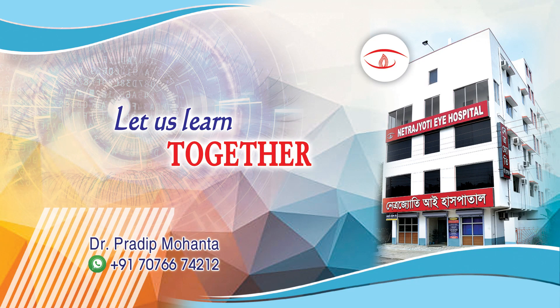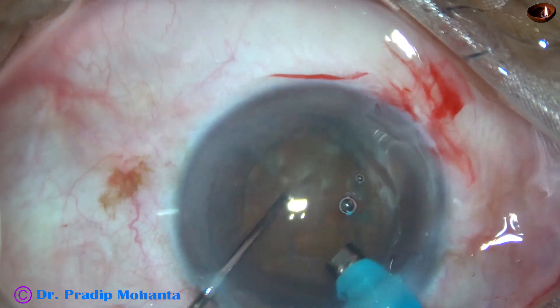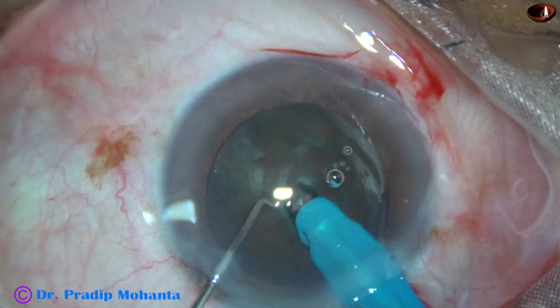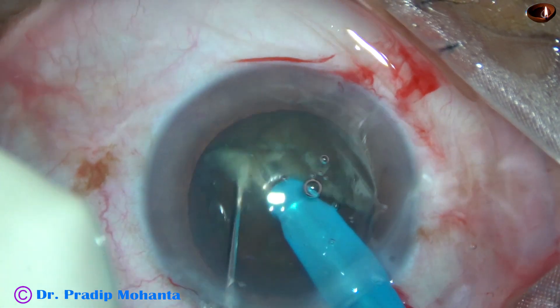Friends, welcome to my workplace at Rana Ghat, West Bengal, India. In this video, we are going to see how to manage a posterior capsular rent when the rent is small and vitreous has not prolapsed into the anterior chamber.